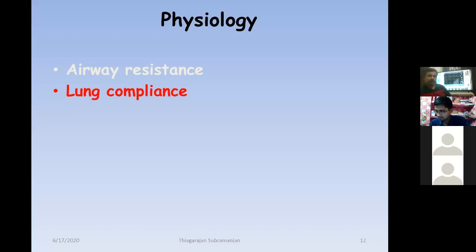These are a few things to always remember, which you can commonly see in obstructive lung diseases, the low elastic recoil methods.